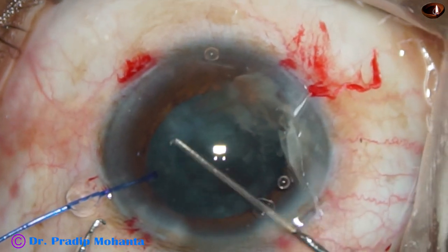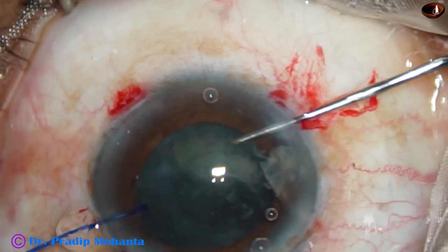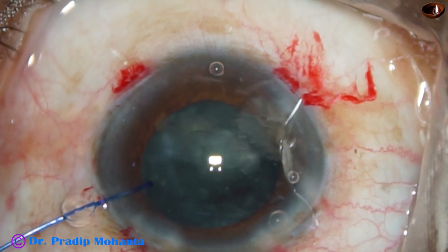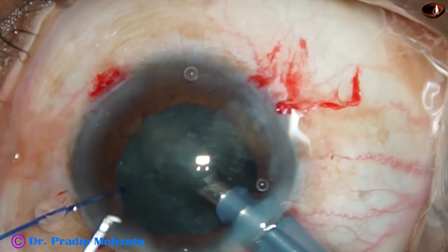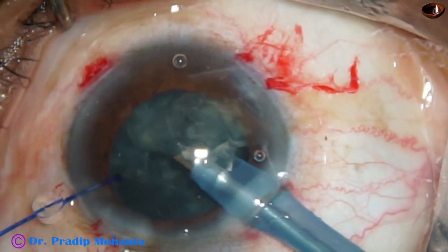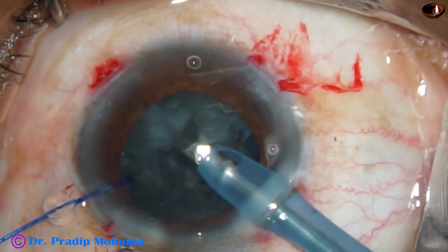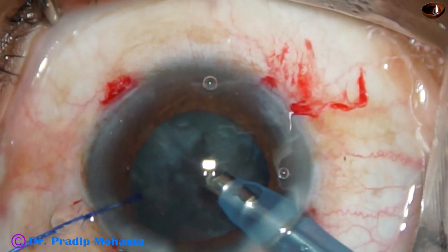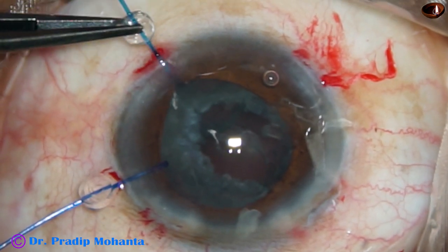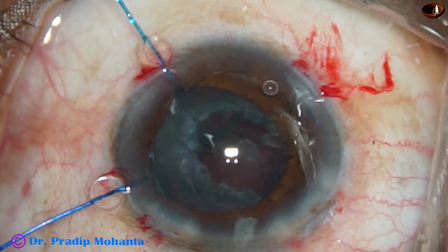Both the fragments have come out. I push these two fragments again down to the iris plane from previous experience and emulsify these two pieces. Nucleus management is not so difficult — we just have to be cautious in such cases. More difficult is the thick epinucleus. At this time the pupil has become small, so I apply the hooks to retract the iris, leaving the rhexis margin for now.